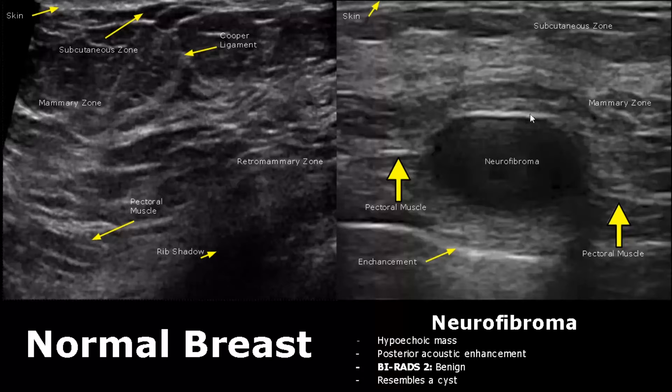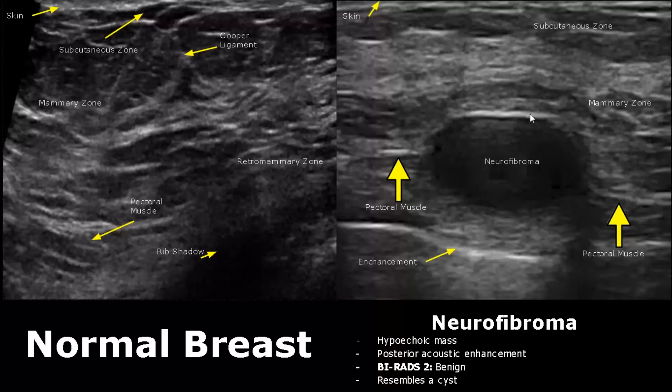A neurofibroma is a rare benign tumor which appears as a hypoechoic mass with posterior enhancement. It is very tricky because it resembles a cyst, so it can be misdiagnosed very easily.